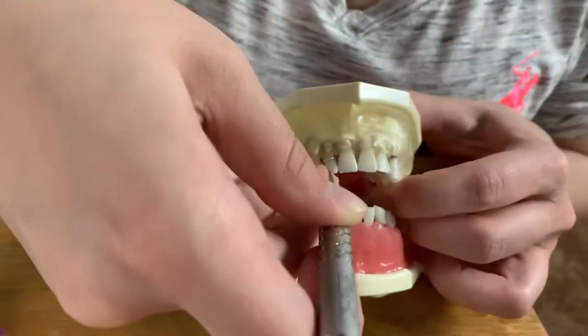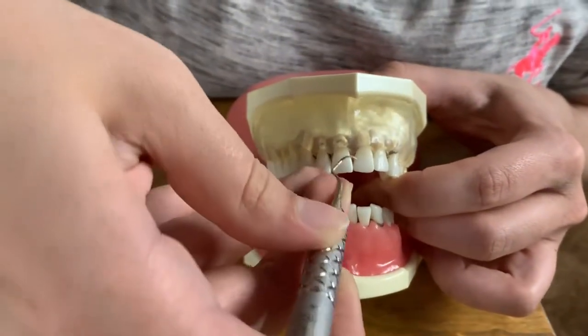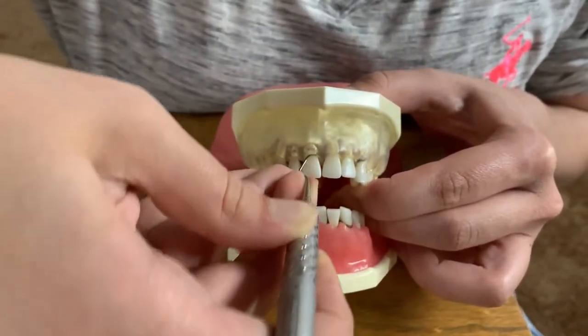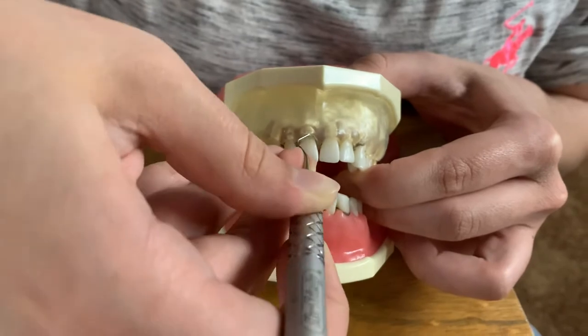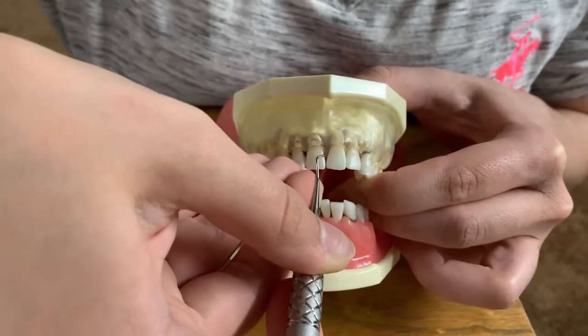You have to roll almost immediately on the anterior teeth, rocking. I end up interproximally. Same thing again — I'm going to start at the midline and work on the away surfaces for the away teeth, fulcruming properly, and then end up interproximally.